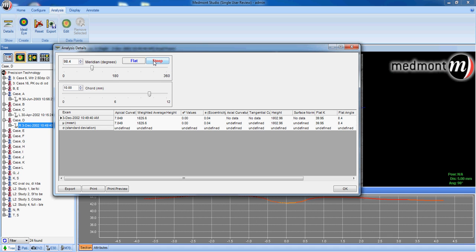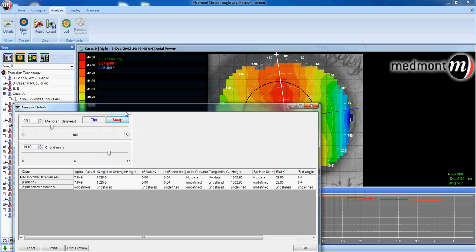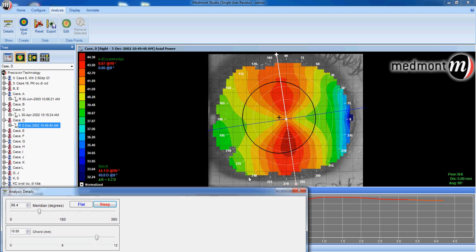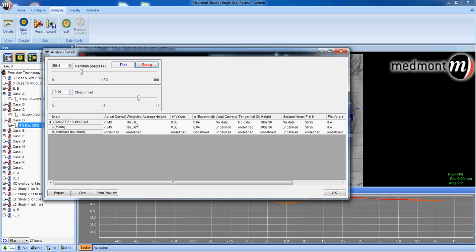There is a huge differential between the depth of the eye horizontally and the depth of the eye vertically. When fitting contact lenses, this would be profound in trying to fit this limbus-to-limbus 4.2 diopter corneal astigmat with a spherical GP lens. Clearly a toric would be required, both because the corneal astigmatism is high and because it's limbus-to-limbus, and because you have a very high differential between the flat meridian and the steep meridian in depth of eye.